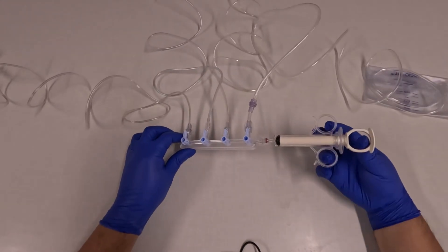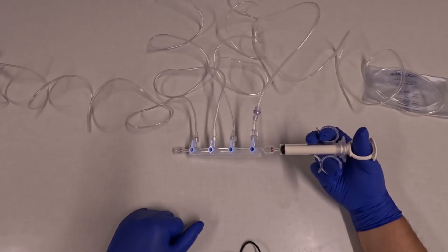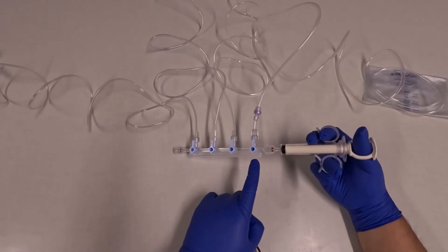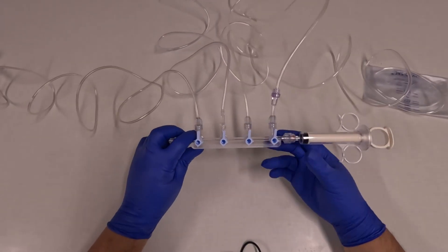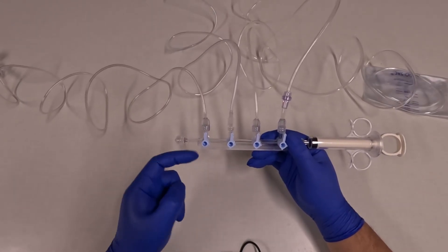As you can see on the manifold, each of the ports has an associated three-way stopcock. This is how you decide the path that fluid will travel when you either withdraw or push on the syringe.